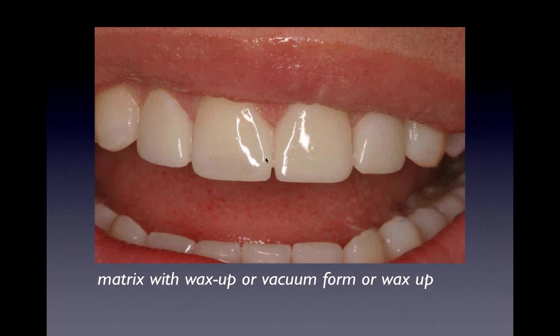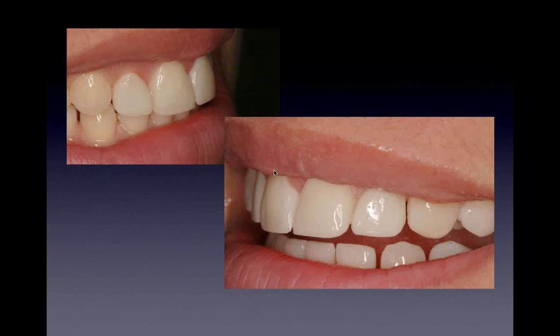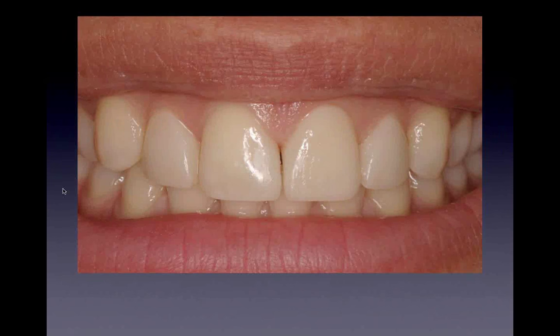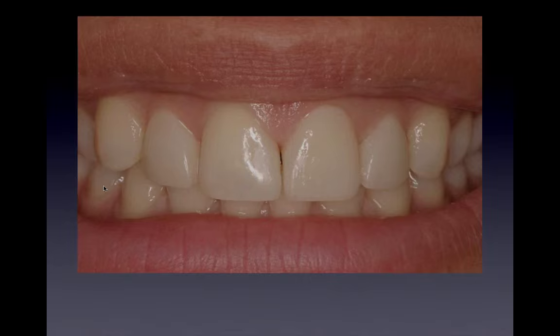And then when I showed it to her, she goes, well, I kind of think I want a little bit of space that I had. So we went in with a disc, and we opened up, you see the lateral view of this, we opened up her central, so she got a little bit of her space back, and she was happier than having it closed. So we kind of just opened it for her with a diamond disc, and got it to that point, and when she smiles, she's really got a nice look for her interproximal.